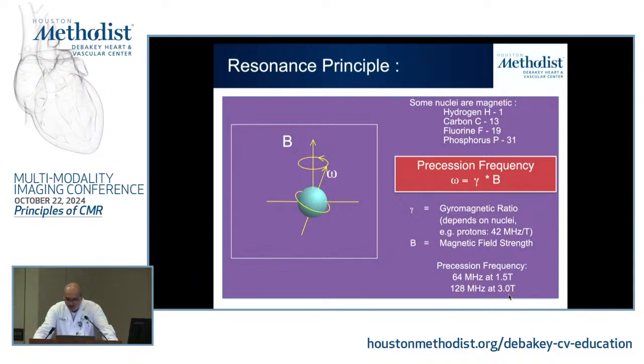Yes, that's a good question. To answer your question, let me put it this way. There hasn't been lots of outcome study to say what happens if I keep you in a 10 Tesla scanner for a prolonged period of time. What you can notice is that in some of these very high field strength scanners, when patients go inside, they oftentimes will notice they feel a little dizzy or woozy. Is that a long-term effect? We don't know. I don't think so.